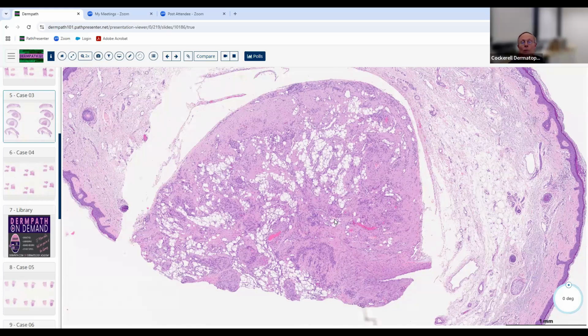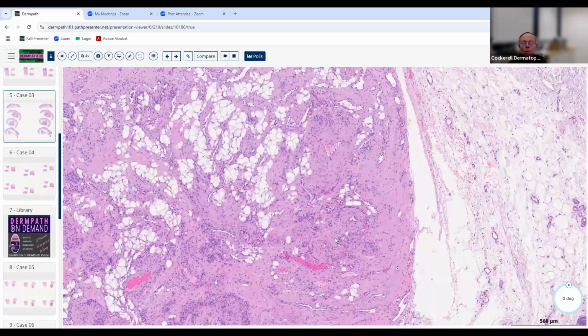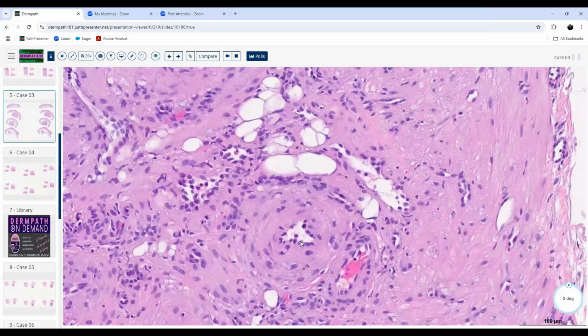And if it doesn't look like one of those three, we may start thinking, well, maybe it's a weird squamous epithelium that's become spindle, or maybe it's a funny spindle cell melanocyte, or maybe it's a funny spindle cell endothelial cell, like you suggested. So those are some other things that can be spindle, but those are the three main ones I want you to think about. So let's look here. What do we see here? Of those three, which do we kind of like here? Yeah, I was favoring more of smooth muscle.